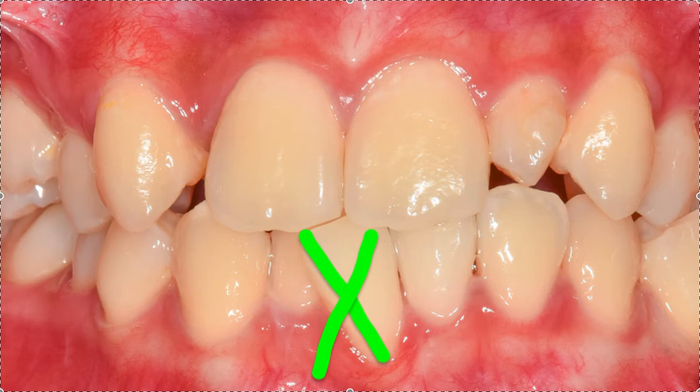And it could even be passive aligners on the bottom if you wanted to. And you could actually start the case on top and put the attachments on top. That's another way you could do it. You can do whatever you want. You just have to say what you want, right?